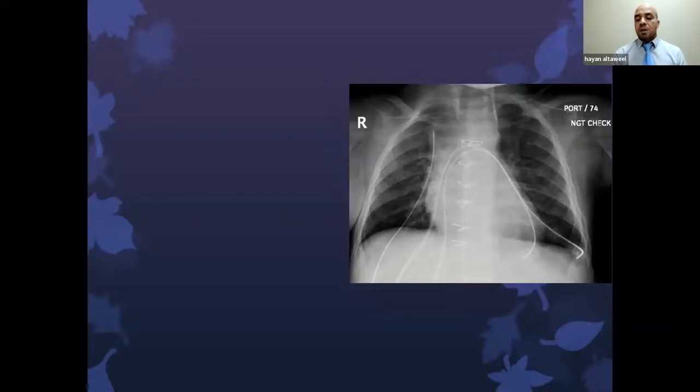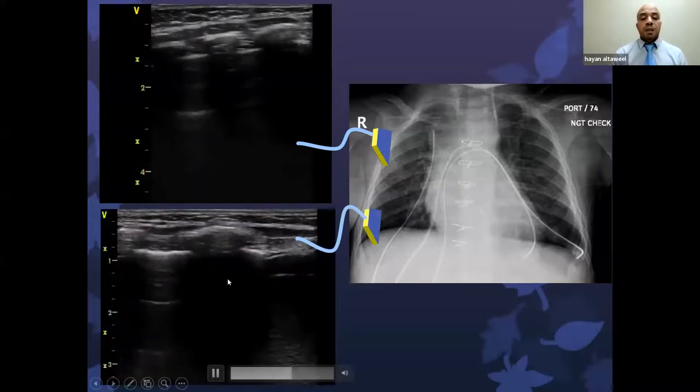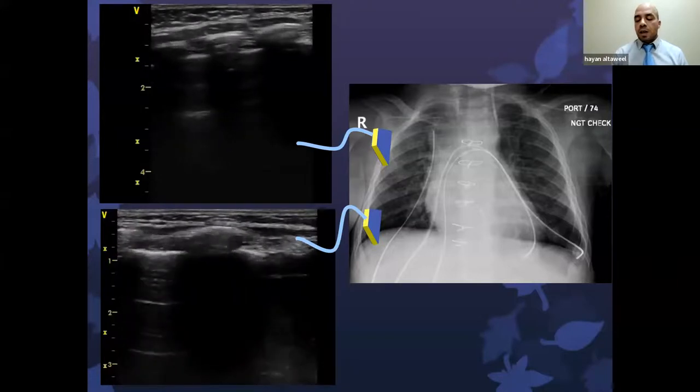Another patient with an almost normal chest X-ray: you are thinking about giving more fluid. Can my patient tolerate more fluid? And you don't want to wait for the X-ray, the technician is busy somewhere. You can also perform lung ultrasound to check and see how dry your lung is. See the A-lines, there is no lung tissue seen here, and almost no B lines. The same in the basal part of the lungs, the same as the upper part, only A-lines, showing dry lung and telling you that your patient is fluid tolerant rather than fluid overloaded.